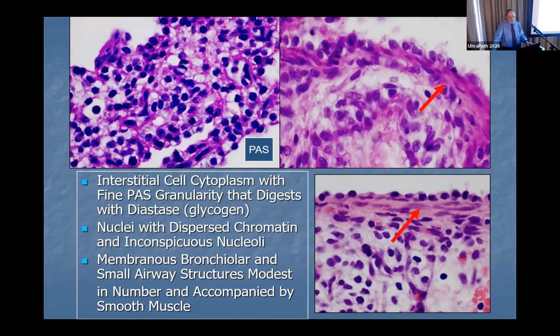In pediatrics, pleuropulmonary blastoma is characterized in 3 different ways. One is pure cystic, one is partially cystic, partially solid, the other is pure solid. And the ones that tend to be cystic, they tend to have a rhabdomyoblastic sort of cambium layer associated with them. Really don't see that. We see sort of more myofibroblastic spindle cells in particular here.